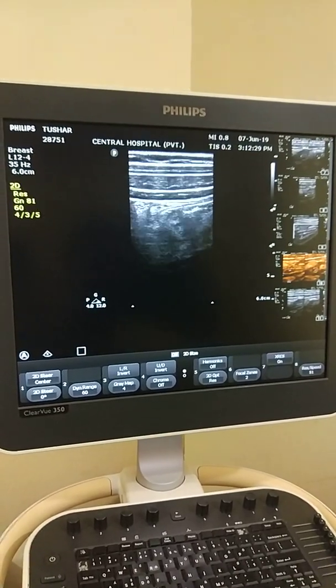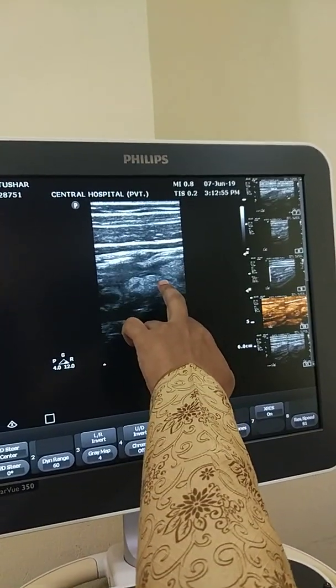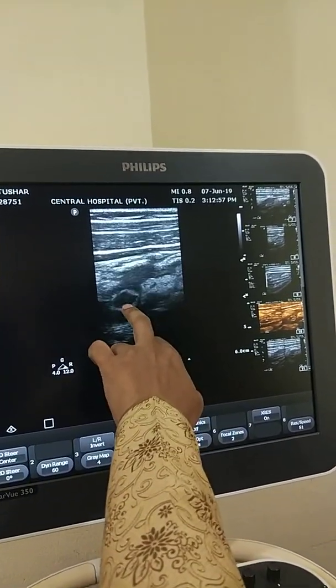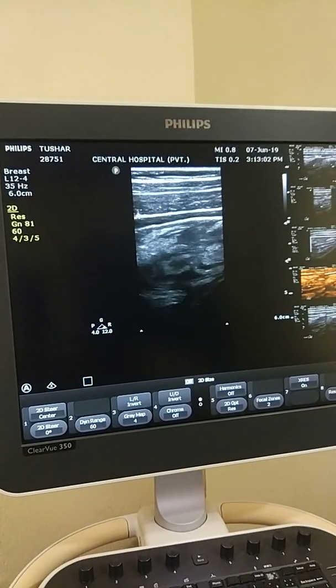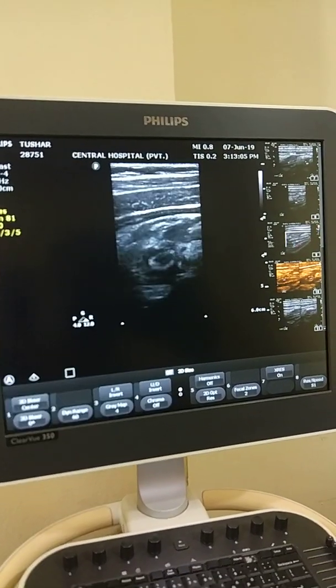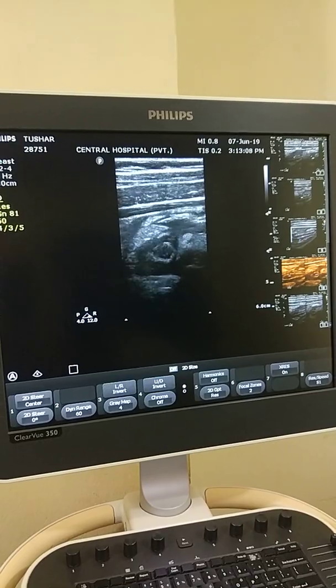Now you can see where I found it. The appendix is not in the right iliac fossa. When I scanned near the right hypochondrium, I found the fat and this is the appendix. So my diagnosis is that this is a case of acute appendicitis. Thank you everyone.